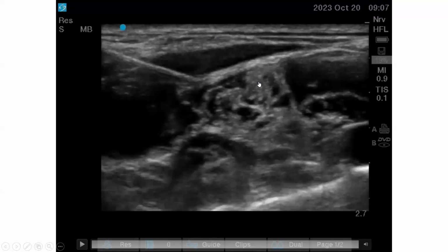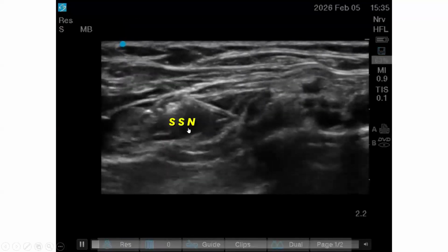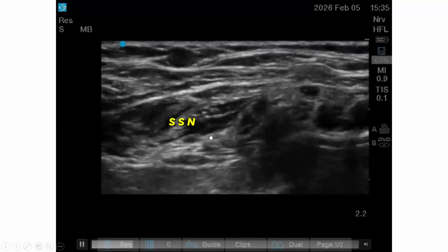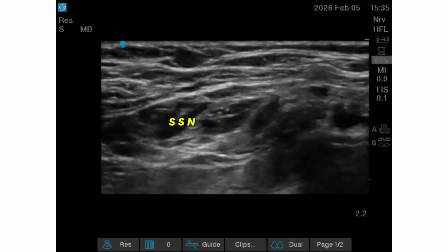Now, the last time I remember, Ritesh had asked whether we can chase the local anesthetic hypoechoic shadows. You can see some of the fascicles here, hypoechoic nodules, and these are the twigs of the brachial plexus. And we are really not sure whether we are going to impale these nerves, these twigs. The third is the suprascapular nerve. You can see this is the suprascapular nerve, which is now totally bathed, soaked with the local anesthetic agent at this point. And this is how you can isolate the suprascapular nerve and block it.